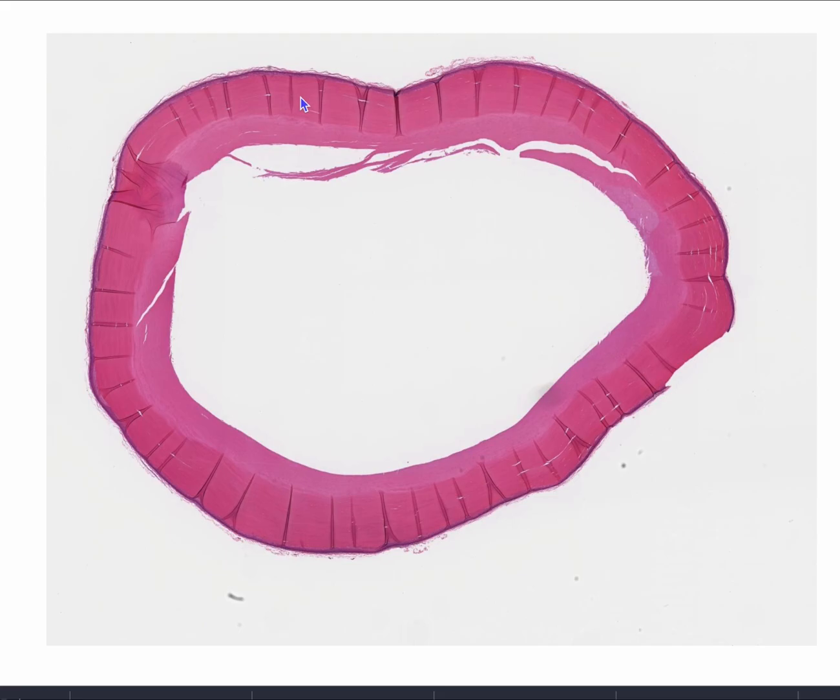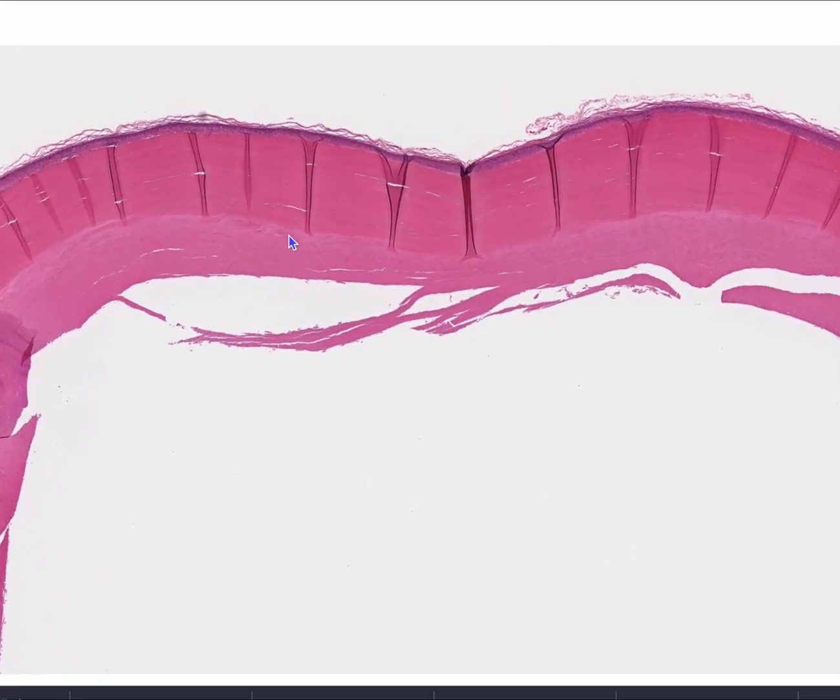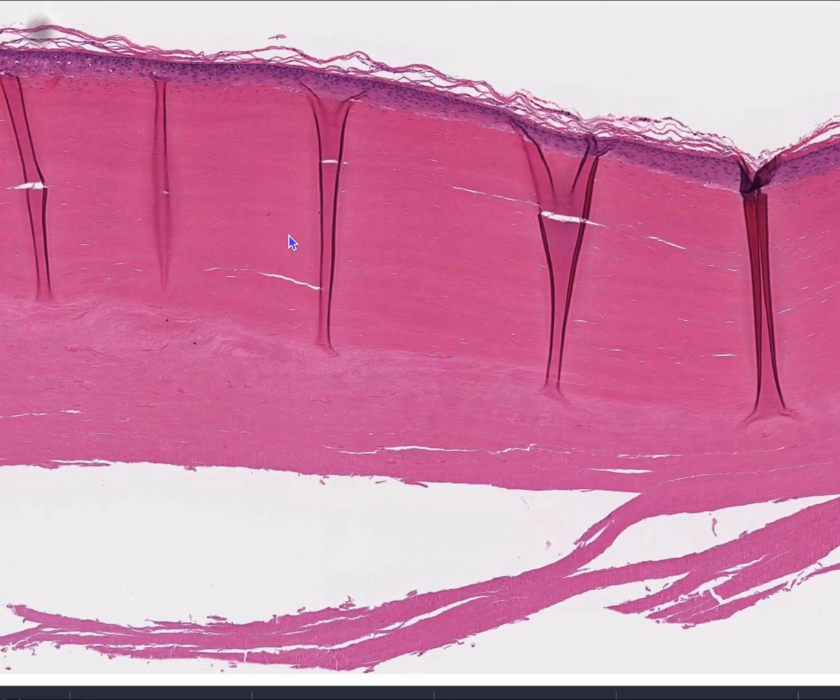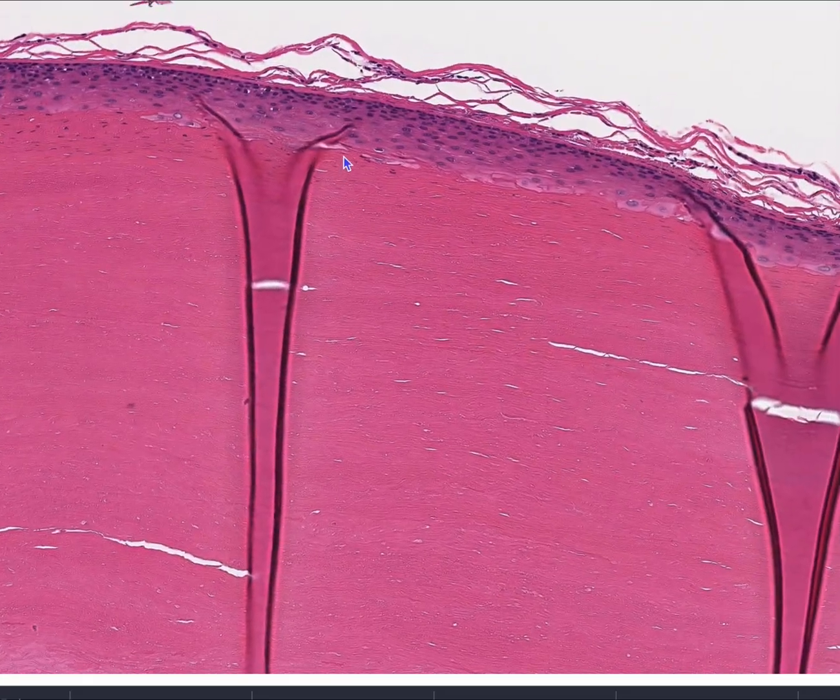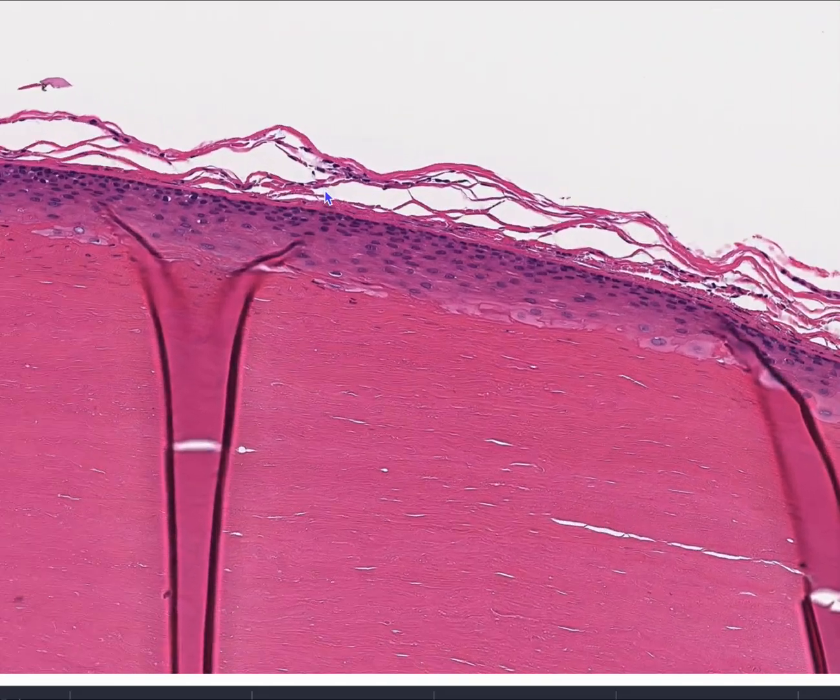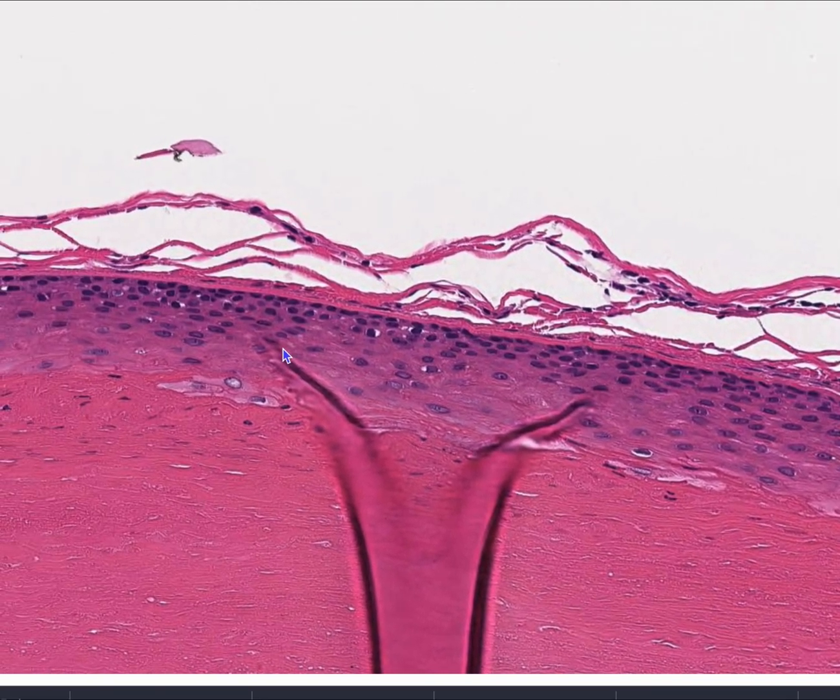So these generally grow on the scalp and they have a very thick keratin, very compact. And as you look in the outer layer, there's going to be a lack of a granular cell layer.